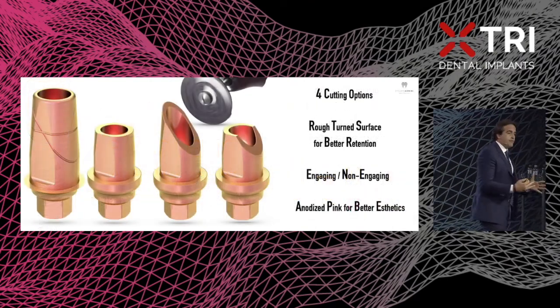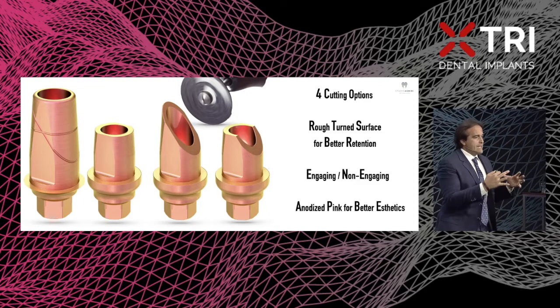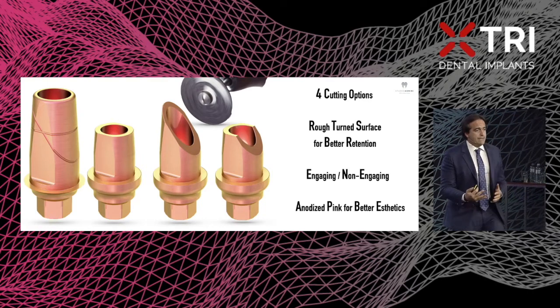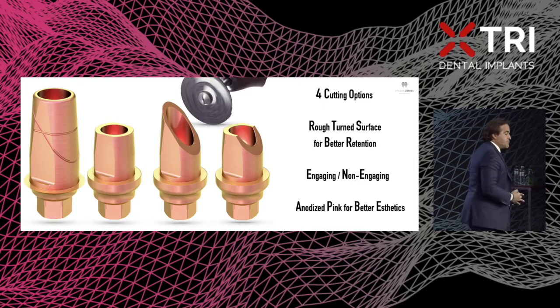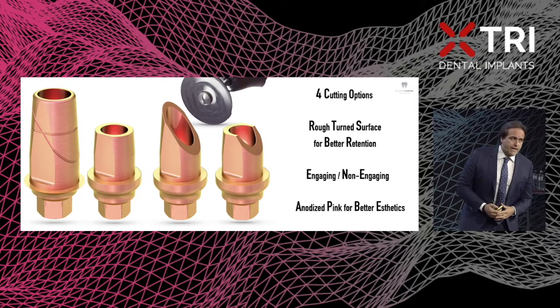3 implant was already updated in the digital field, because despite the problems with T-bases, they created extremely nice titanium bases that we were able to use with 4 cutting options, for example, with the anodized pink for better aesthetics, with a rough turned surface for better retention.